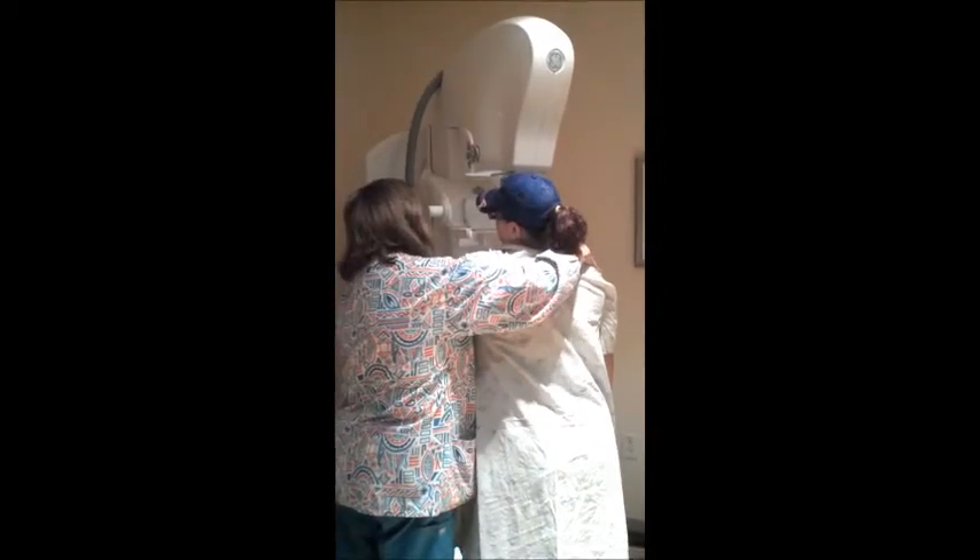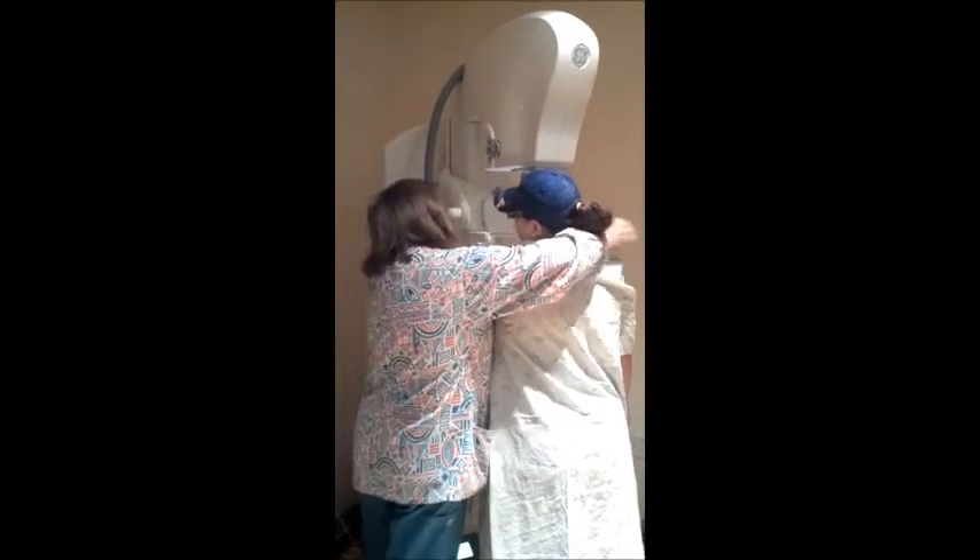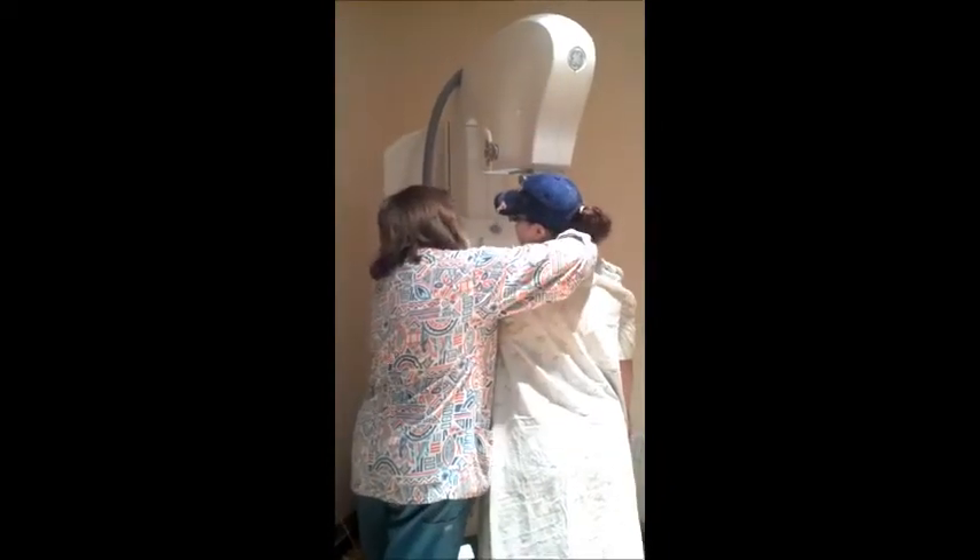Just really take your breath, literally just nice and loose. It will pinch less if you kind of just breathe easy.